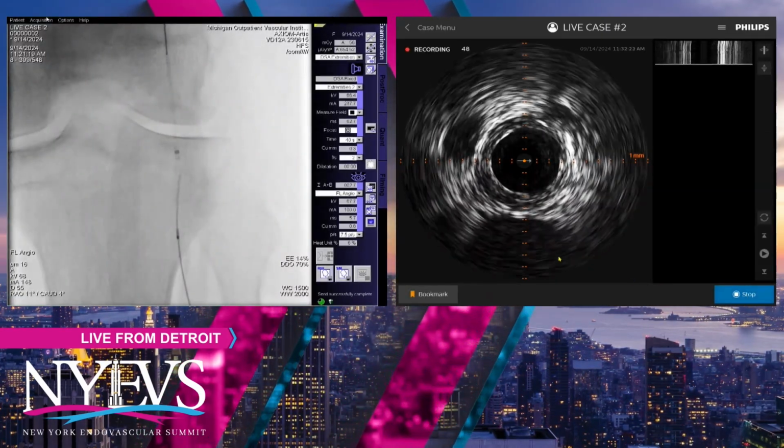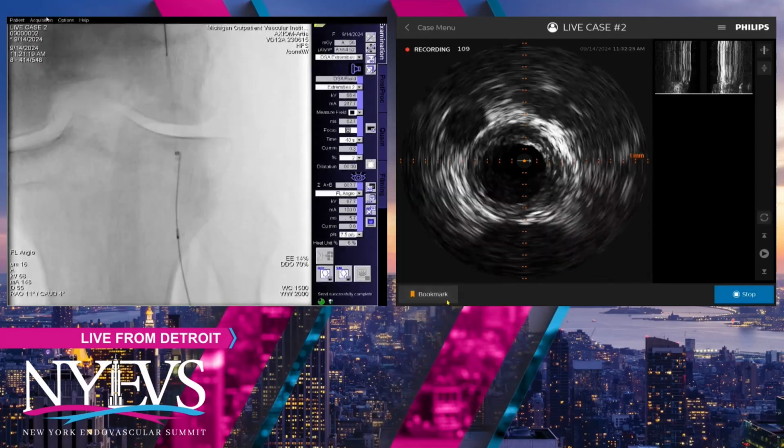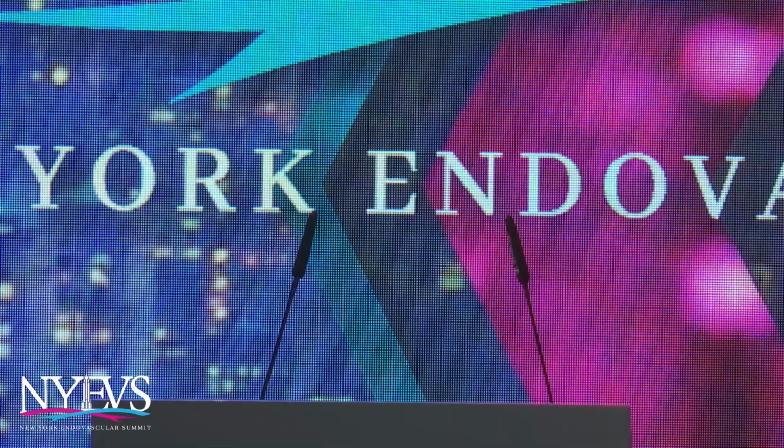We're going to let you get that wire through and through. The final slide regarding that algorithm was very, very helpful. Let's go back to the case. Let's go back to Michigan.